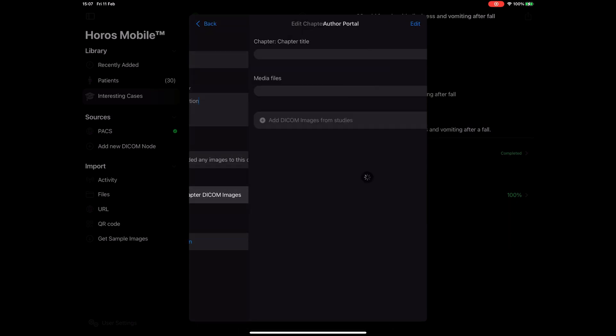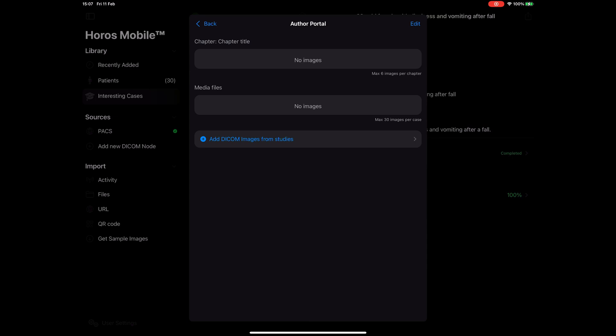I can also add DICOM images by tapping on the manage chapter DICOM images button. You may notice that we are not using JPEG images or any other rasterized file formats. We wanted to give you the full experience of a DICOM viewer so that all users can manipulate the images that you share with them, as they would in real life. Users will be able to change the window width and level and have a more immersive experience with your case.